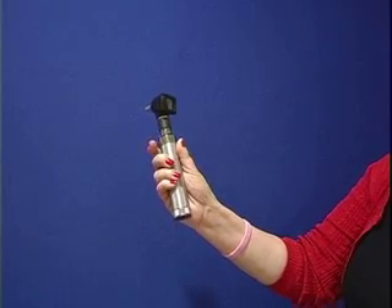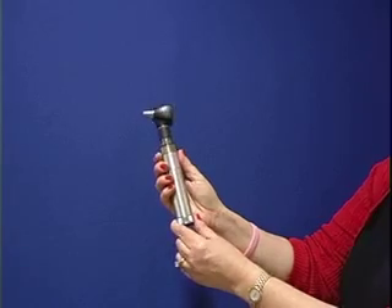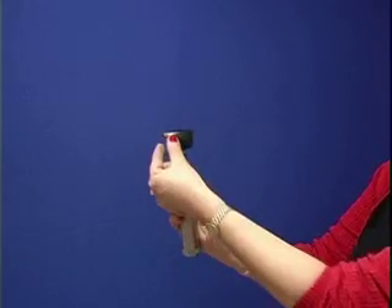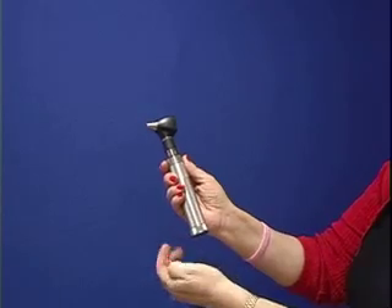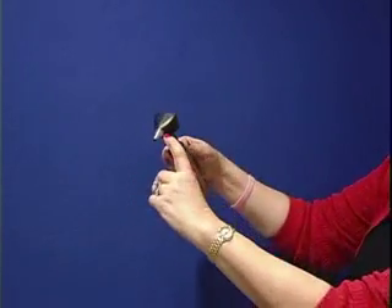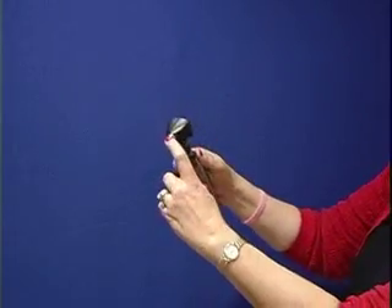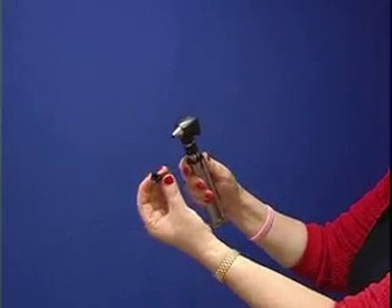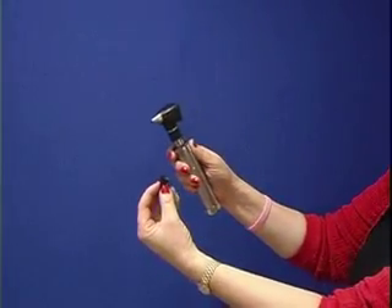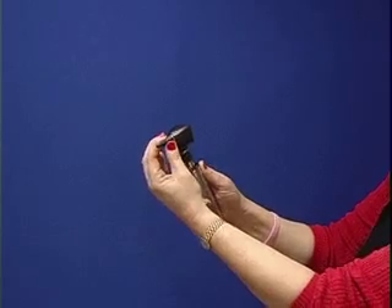The otoscope is the instrument that we use to examine the middle ear and the outer part of the external ear. It is a very simple instrument that has an area for a speculum. The speculums that we use are disposable. You can see that there's a slit on the otoscope and a little ridge on the speculum. You use the largest size possible for the ear that you're examining — you just put it on and it locks.